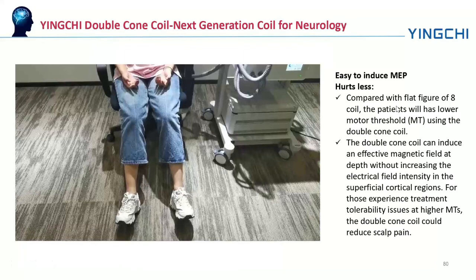As you can see in this video, with only 30% of the intensity, the leg motor evoked potential is clear, so the leg motor threshold is clearly evoked.